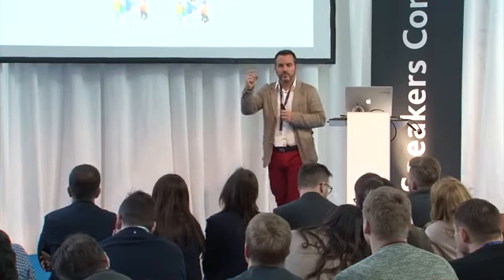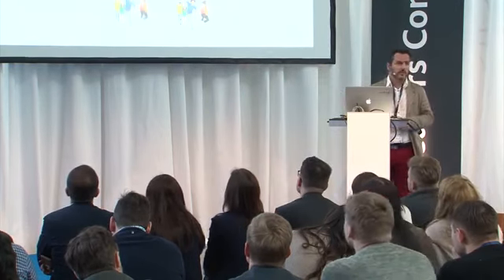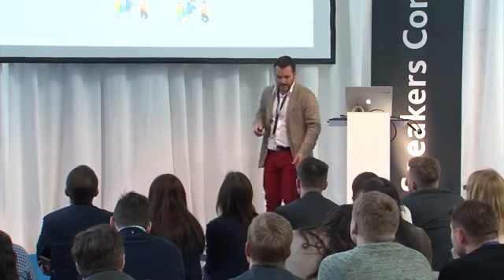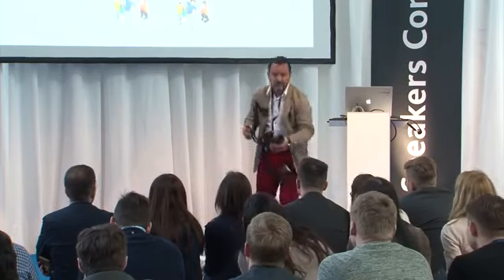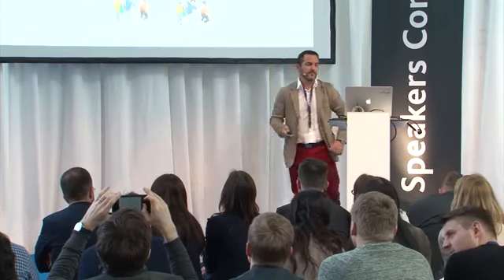That means that when we push the button, we make the photo so fast that even if the patient is moving or we are moving, the picture will be very still and will look very nice. So we don't need optical stabilization. Even on my camera, I have the Tokina lens, and this one doesn't even have optical stabilization. I've been using this lens for more than 2 years, and all my pictures look very sharp, and I don't need it because I use a short exposure time.